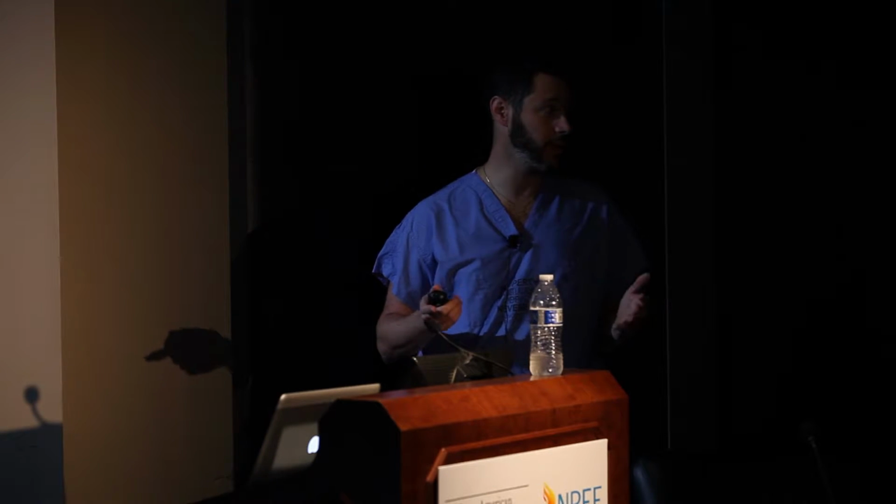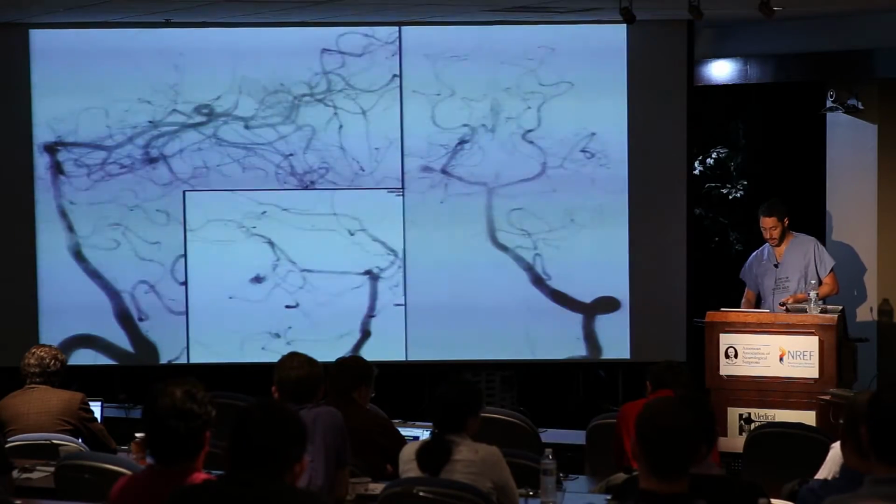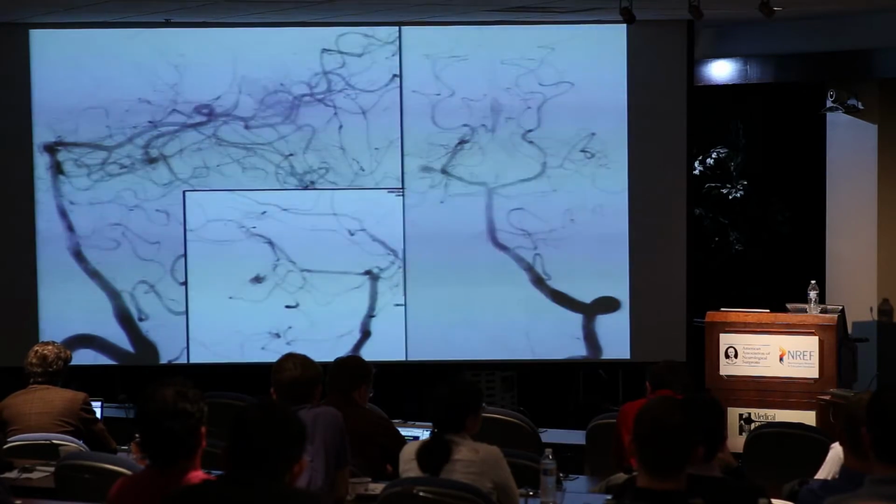That has something to do also with, are there high-risk features? What's the presentation? Is it subarachnoid hemorrhage? Are you looking for an aneurysm, like Adam said? Or is this a parenchymal hemorrhage from, I don't know what part of the nidus? Okay. So I do always get angiography when they show up, because I want to know what I'm dealing with. Otherwise, I don't know whether I can really wait, right?